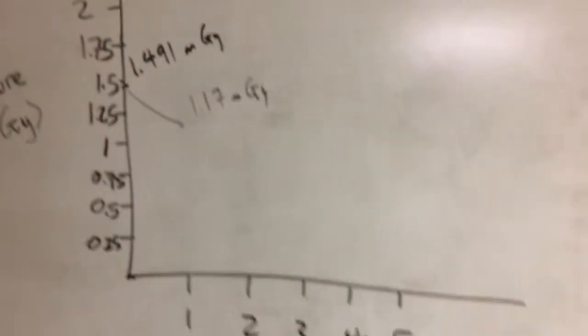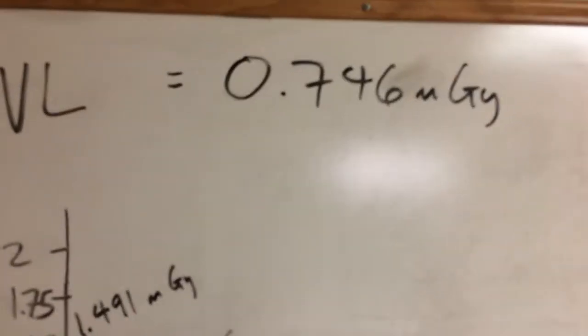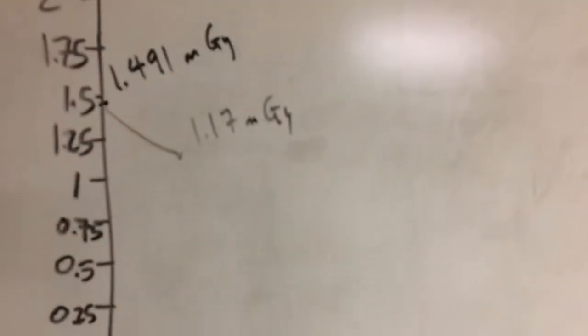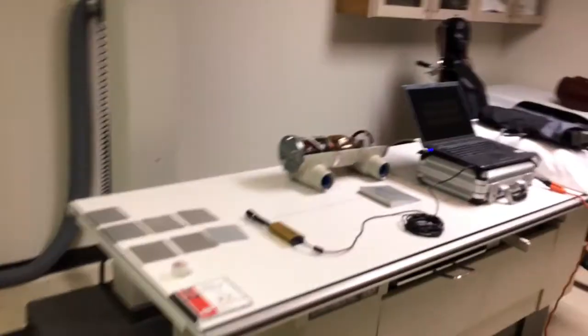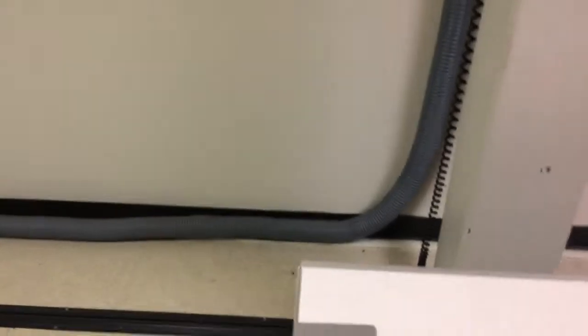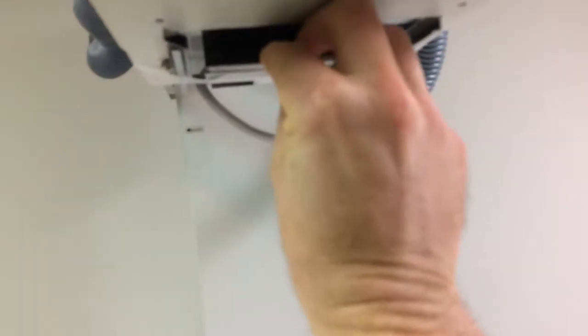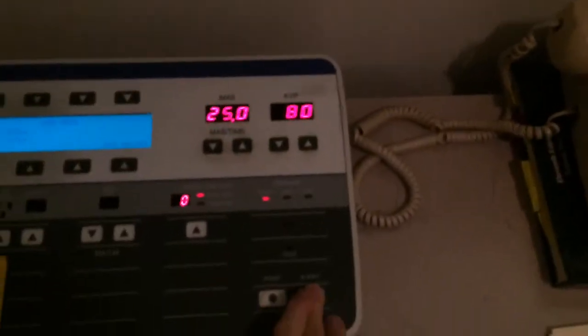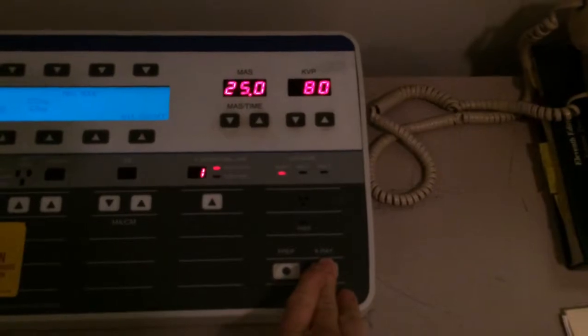Let's go ahead and add some more aluminum because we're trying to get to that number there. Then we'll know we're at the half-value layer. I'm going to grab one of these millimeters here, slide it in, and we'll make another exposure. Now this might seem like about as interesting as watching paint dry, but you'll see where this starts to get interesting.